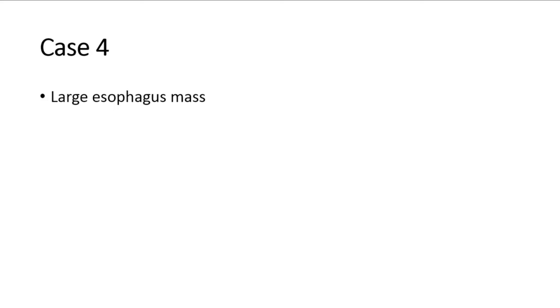Still in the esophagus, although we're almost done, this next case, let me mute my phone here. Sorry about that. This is a large esophagus mass, let's say 15 to 20 centimeters, extending down into the esophageal lumen.